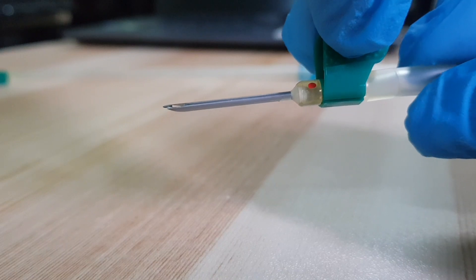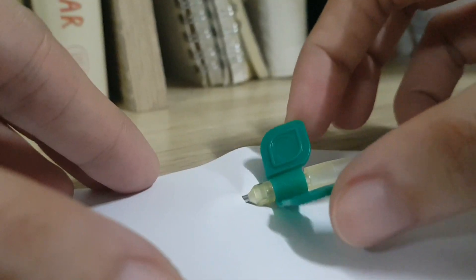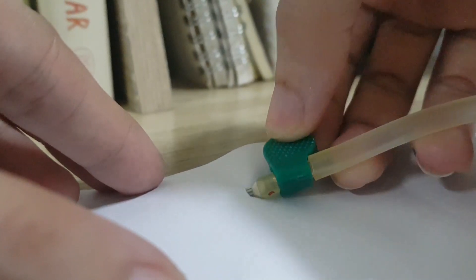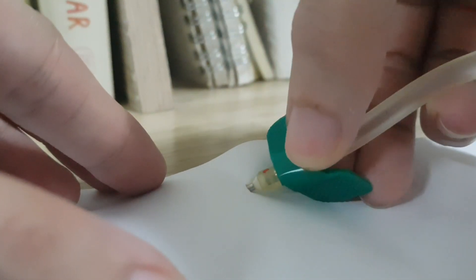You can do this instead. Take note: flipping is different from rotating. Flipping is not recommended because when you do this, you flip the fixed wing, which can cause tearing of the AVF.